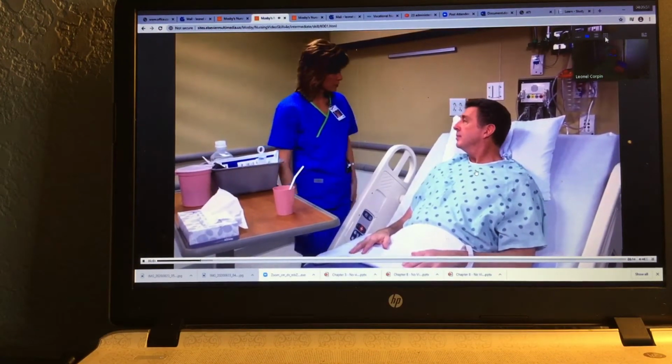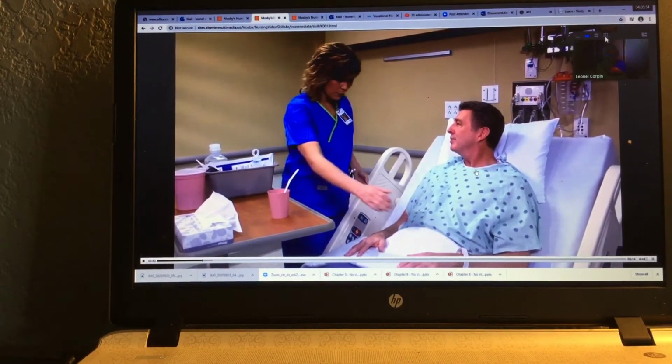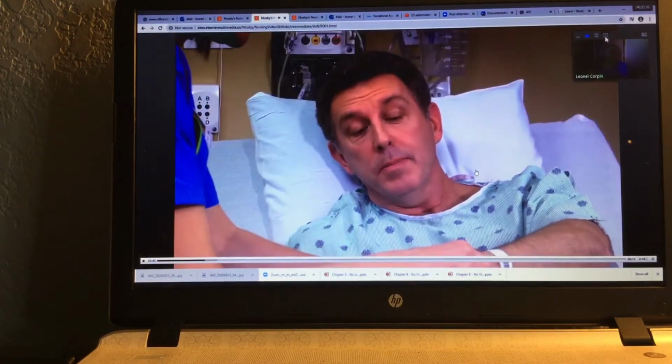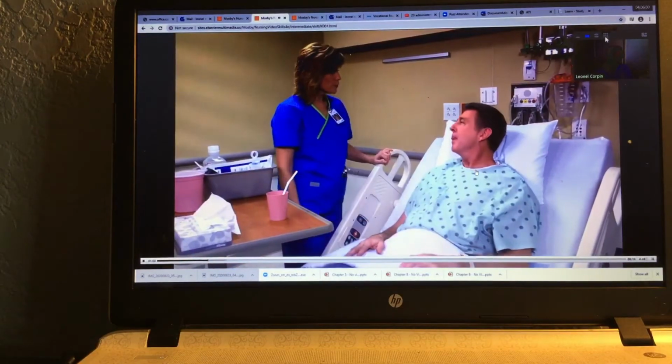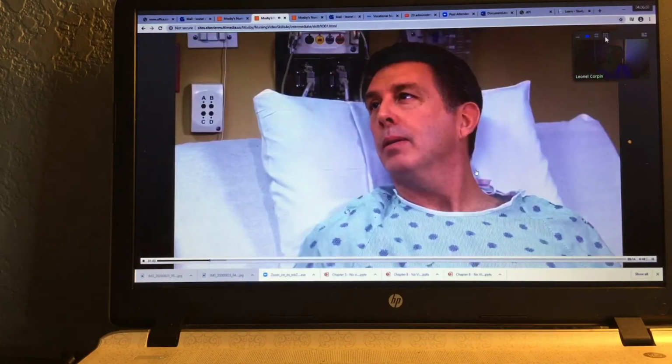My name is Jennifer. I'm going to be your nurse today. Good morning. Can you state your name for me, please? Greg Wilson. All right, and your date of birth? 1856. All right, thank you. Explain the procedure to the patient and assess his cough and gag reflexes.